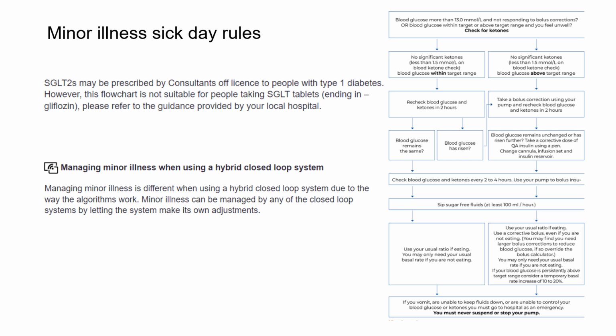We recommend blood glucose checking rather than CGM use when managing illness, so sick day rules information refers to blood glucose to highlight that illness is a situation where blood glucose checks are preferable to sensor glucose. Sick day rules differ from MDI DAFNE as they include the option to increase basal rates using a temporary basal rate in minor illness sick day rules.